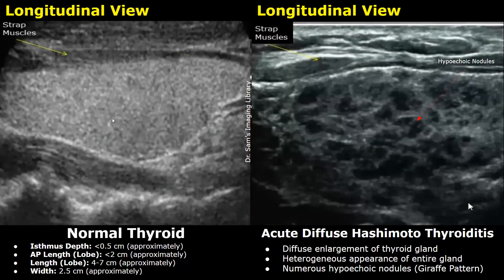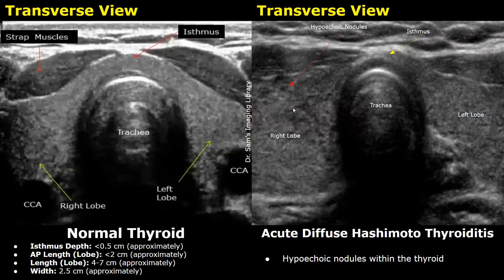This is a thyroid lobe in the longitudinal plane — normally it has a homogeneous hyperechoic appearance. In this case, however, the thyroid lobe has a heterogeneous appearance and is filled with various hypoechoic nodules. The thyroid was enlarged as well, showing a giraffe pattern. This was also a case of acute diffuse Hashimoto thyroiditis, with an enlarged gland and prominent hypoechoic nodules.